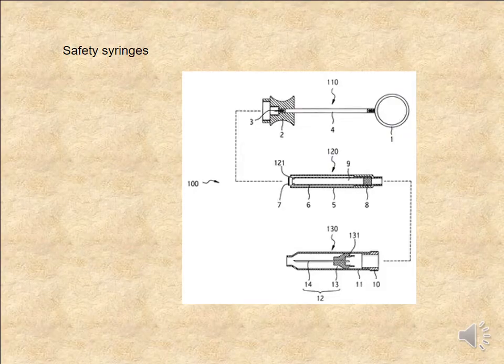The safety of the syringe. The syringe must be safe and have no high pressure, giving a slow injection of local anesthesia inside the tissue. Mainly we use it for subgingival or supraperiosteal types of injection, so it must not produce high pressure, and it should be safe to change the carpule in the syringe, and easy to remove and easy to sterilize without any damage to the syringe.